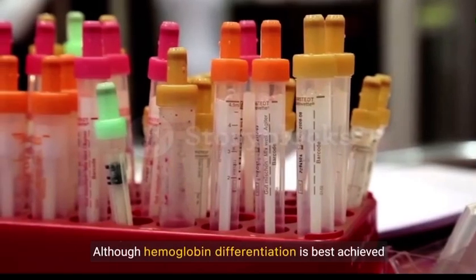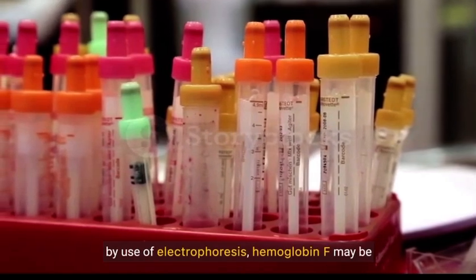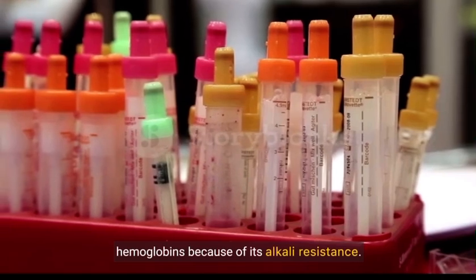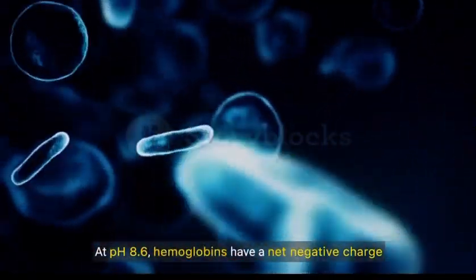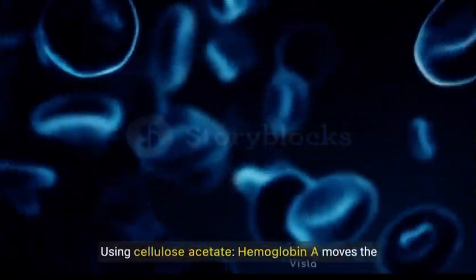Although hemoglobin differentiation is best achieved by use of electrophoresis, hemoglobin F may be differentiated from the majority of human hemoglobins because of its alkali resistance. At pH 8.6, hemoglobins have a net negative charge and migrate from the point of application toward the anode.